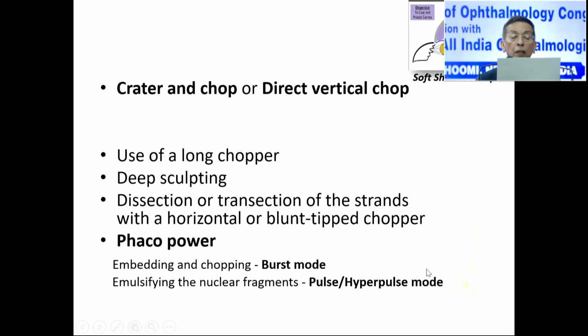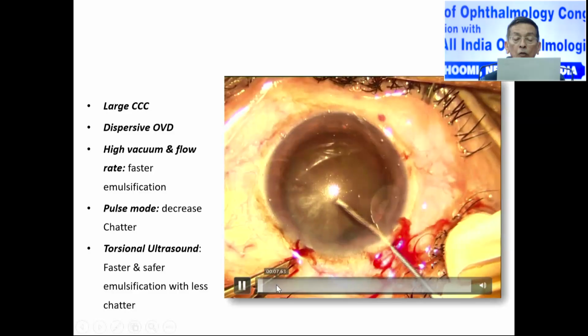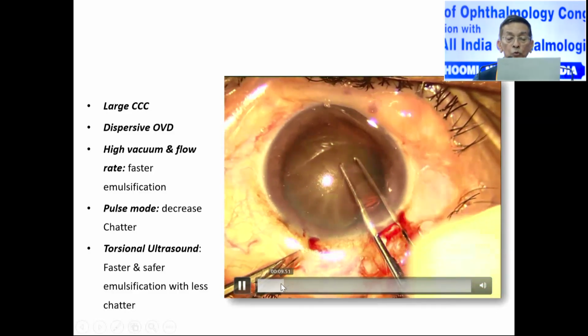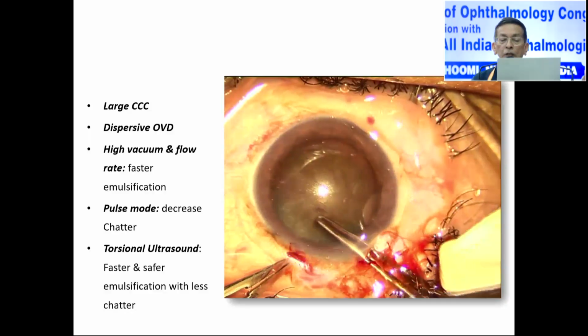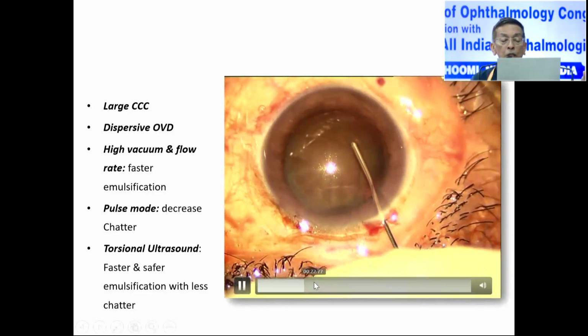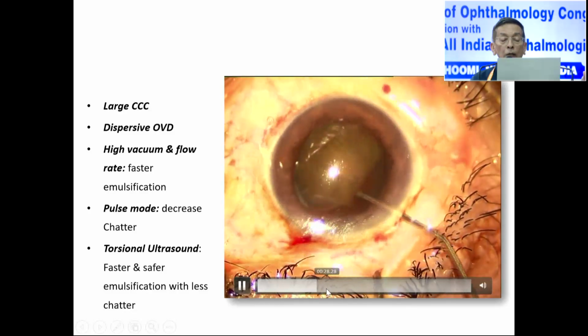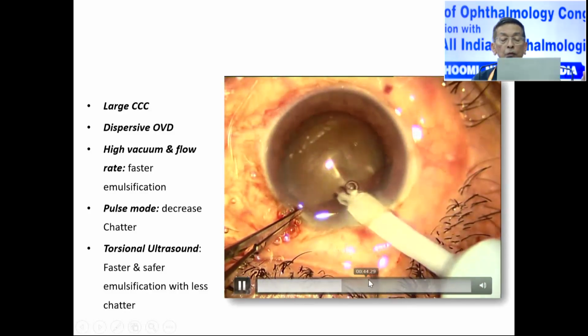In the hard cataract, you have to use a good viscoelastic centrally, and you need a larger rexis in this because the manipulation is more, so you require a larger rexis in this case, and hardly half a minute.